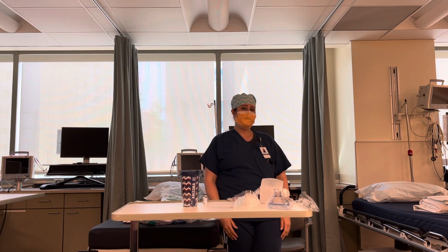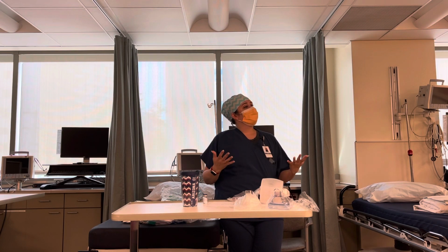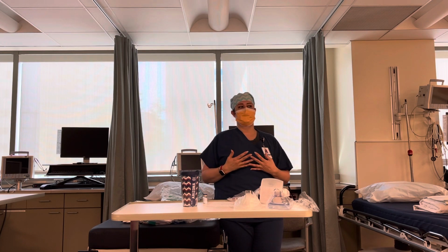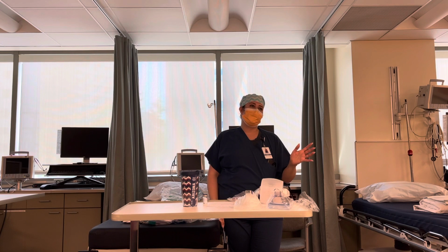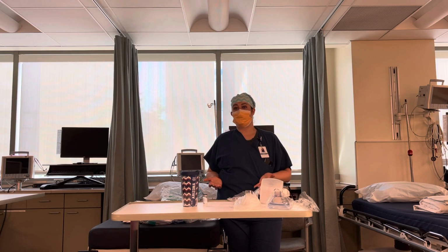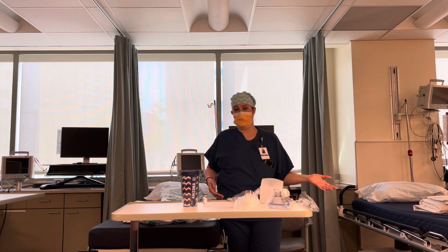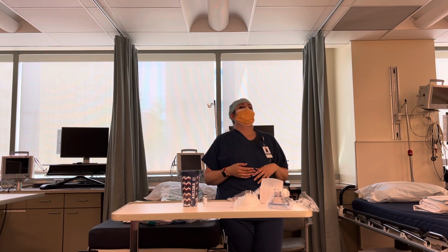So in an OR setting, these are things that we deal with regularly, and it's not that big of a deal because we have an anesthesia machine behind us. We could just be like, okay, this plan isn't going well, give me 5 minutes, I'm just gonna intubate them. We don't have that luxury here. We don't have all that here. We can't just decide to switch to a general where we tube them. We don't do that. So we're trying to do everything to avoid that situation.